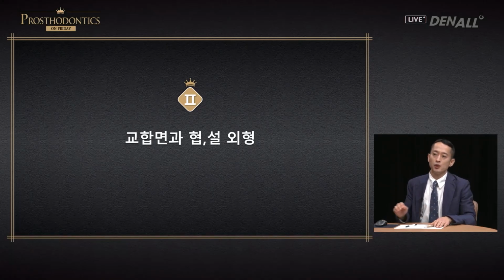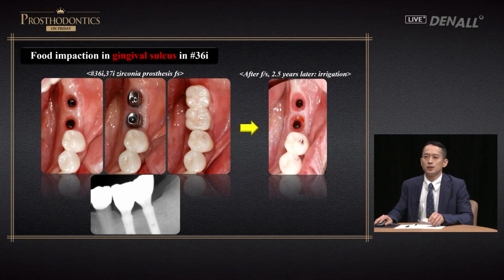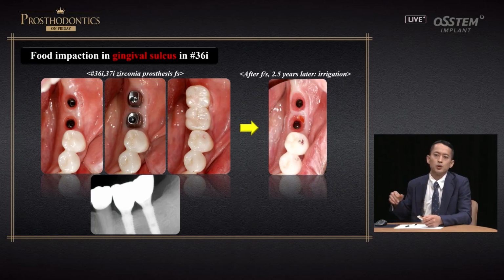Next, I'm going to talk about the occlusal surface as well as buccolingual contour. In this case, the implant was placed by the resident. The resident graduated and I completed the prosthesis. I thought that this was problem-free. While I was following up with the case, I did not detect this issue.